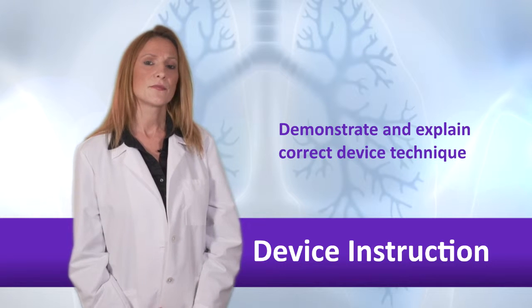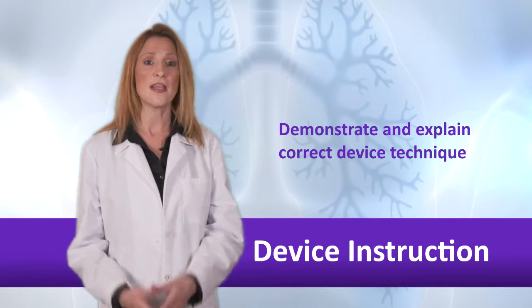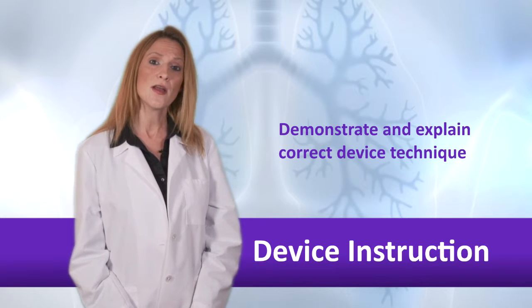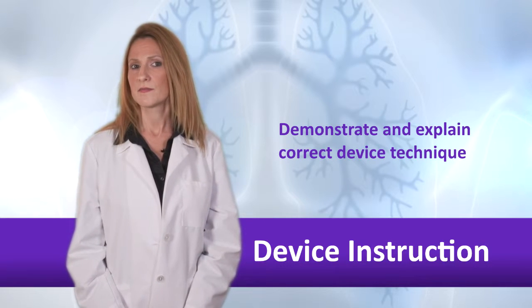Repeat this phrase. Breathe out first. It's what is to be done. So you can take a deep breath is the reason for the action. Here are some other examples. Be sure to blow out away from the device so you don't blow the medicine away. Hold the device totally level. By tipping it, you can lose the medicine.